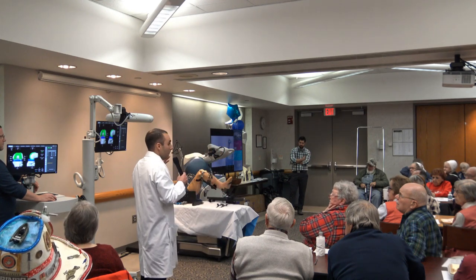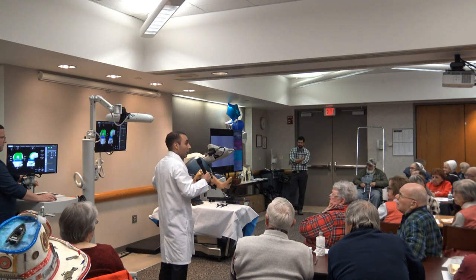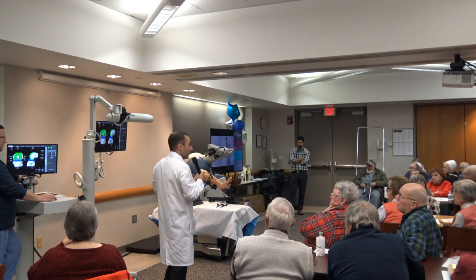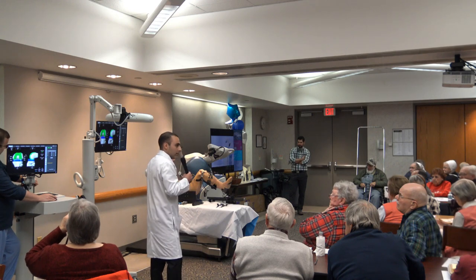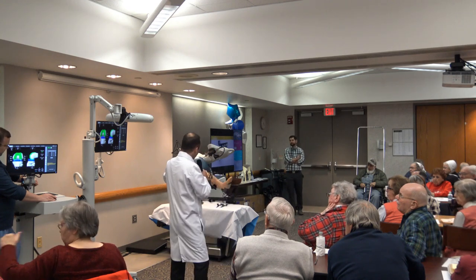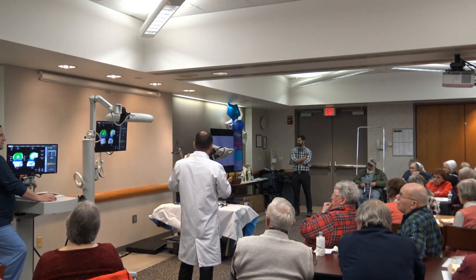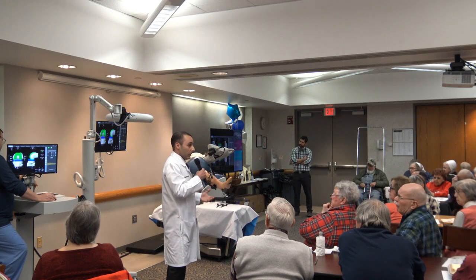Previously, we would base our implants on templating and what we thought it should be, then gather data intraoperatively by feel. If it wasn't balanced, we'd have to do soft tissue releases to make it balanced. Now, instead of those extra releases, we can manipulate the implants to get that same balanced knee. The same approach applies for a unicompartmental knee — precisely plan implant placement, achieve balance, and get a knee that feels more like a native limb.